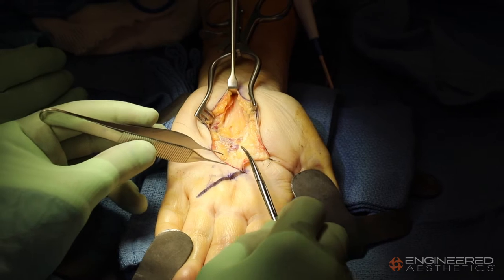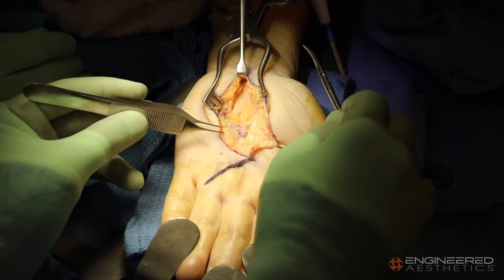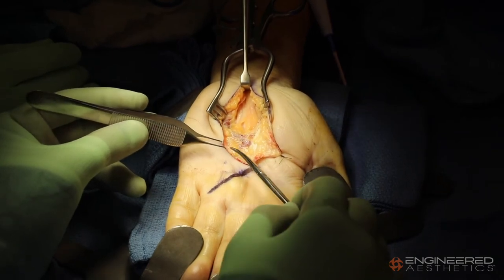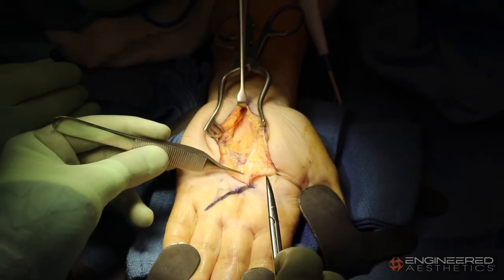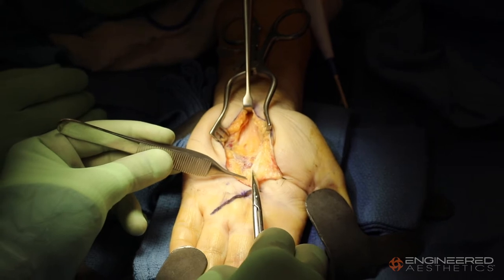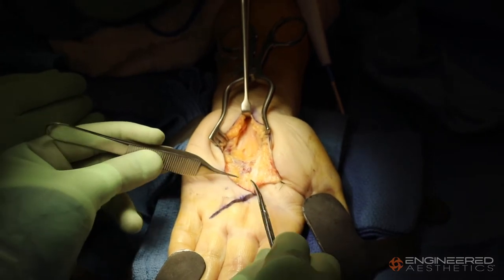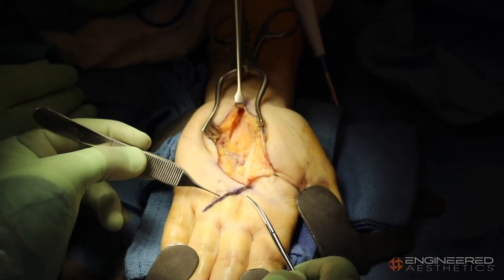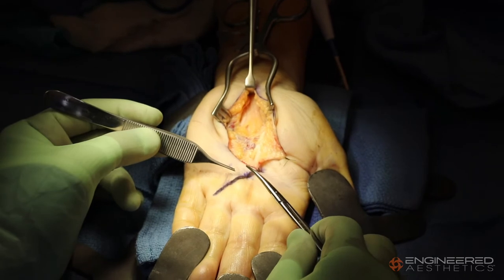The other fantastic thing about this patient is the anatomy. This is the palmar arch — the arterial supply where the radial artery and the ulnar artery meet in the mid palm and provide the individual digital vessels that branch off to the individual fingers as well as the thumb more radially. And then finally the palmar fascia — this looks like normal palmar fascia, but as we move distally we'll start to encounter the Dupuytren's cords, which are nodules of disorganized collagen fibers that make up the palmar fascia and can restrict the motion of the fingers, cause contractures that prevent extension, as well as pain and discomfort during gripping activities.